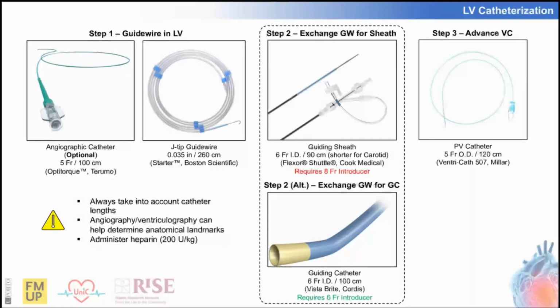So next, you need to advance your sheath or guide catheter over the wire, and we prefer to use a sheath as it comes with a dilator and makes advancing over the guide wire much safer. Using a guide catheter is also an option, but because guide catheters do not have a dilator, the space between the guide catheter tip and the guide wire can cause damage to the aortic valve.